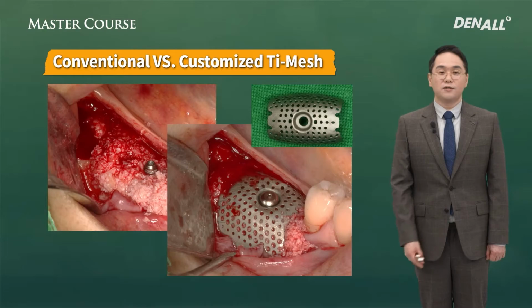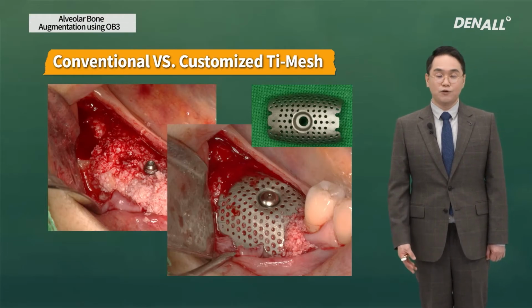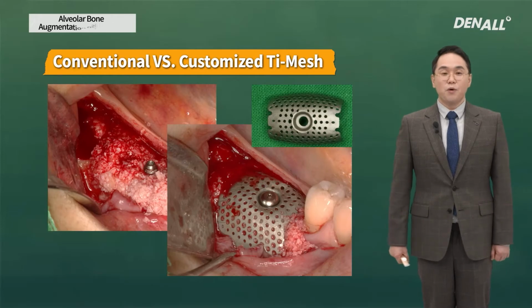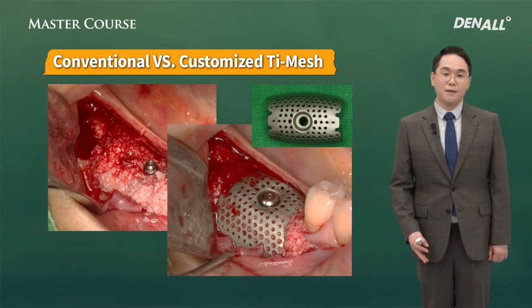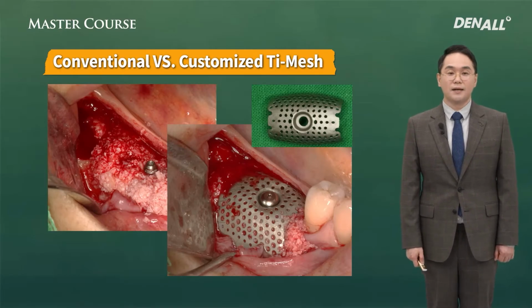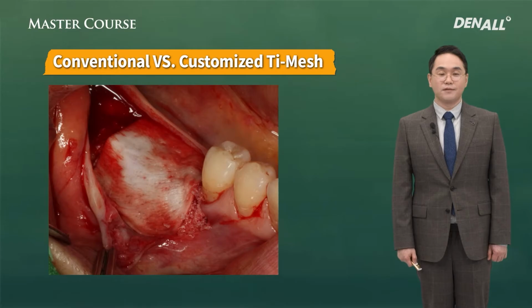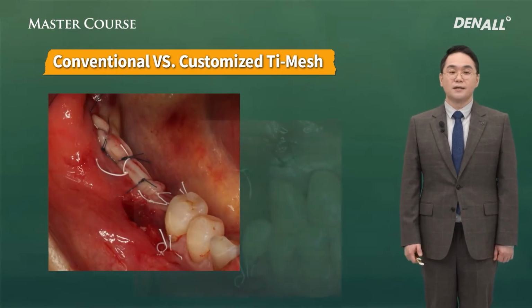After that, as you can see, the patient's gingiva biotype is very thin, so there is a risk of exposure. Just like OSSTEM, the Jawbuilder is preformed and there is no line angle area, less exposure risk, but gingiva biotype is thin, then edges can be exposed. To minimize it, OSSTEM membrane covers the site. Next, the primary closure.